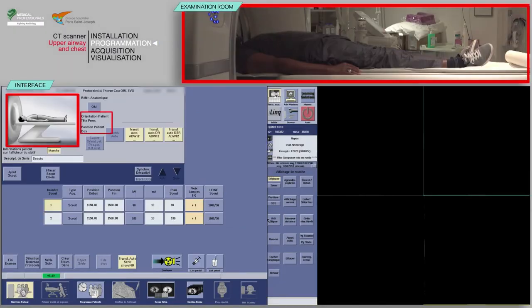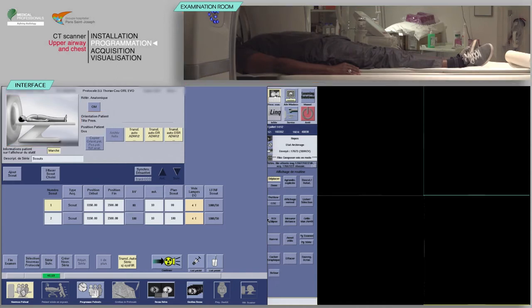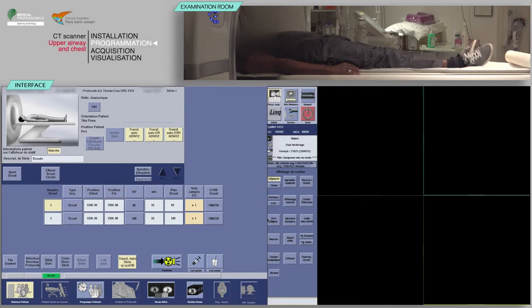Check that the patient's position on the table matches with the one indicated on the monitor. Note that here the patient's orientation is head first. After checking the scan parameters, click on confirm.